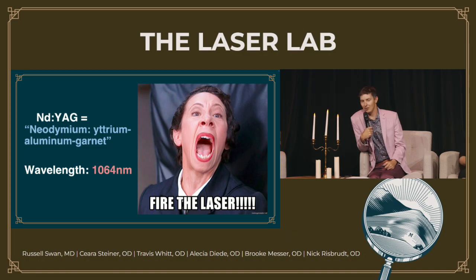They love to know that it's a yttrium aluminum garnet laser, and especially if you work here in Bozeman where there are like 7 laser companies, they're all super interested in knowing exactly what type of laser you're using to laser their eye, which is fun. And the wavelength is 1064, which occasionally a patient will be really interested in knowing, so I have to constantly remind myself what it is, because otherwise I'll forget, and they'll ask me, and I'll feel like, oh, I should still know that.